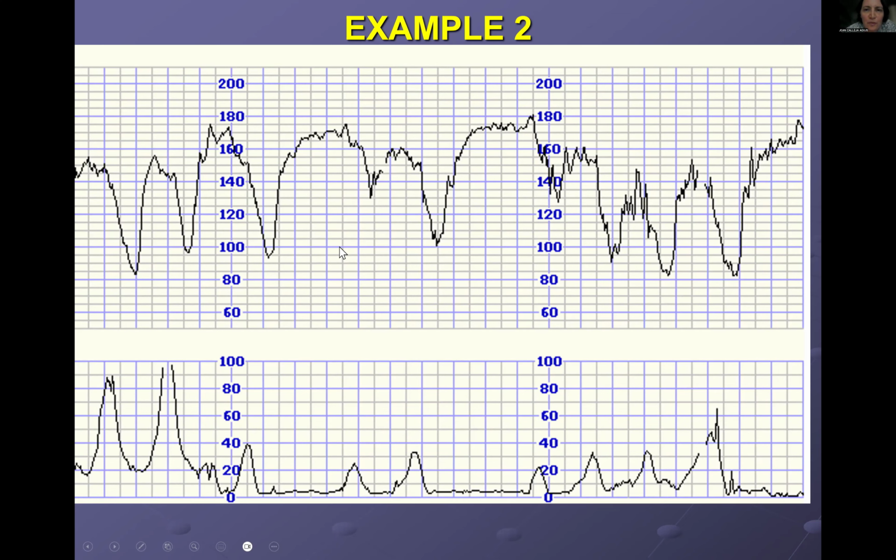So what's your overall plan? Overall plan, this is a pathological CTG, because we have 2 or more pathological features. And so in this case, in my judgment, I would say maybe expediting delivery. For sure, that's the best option, yeah.